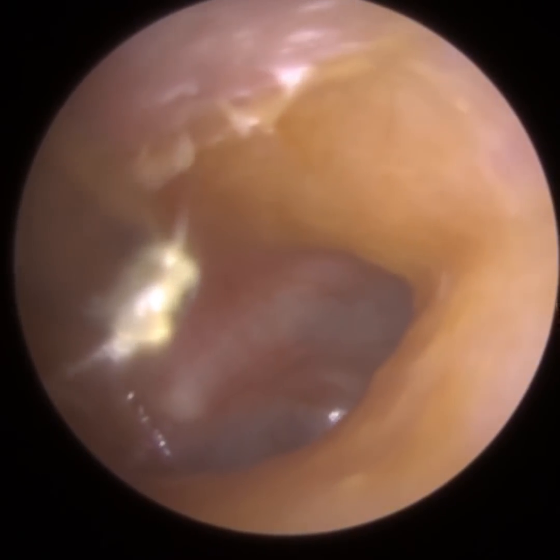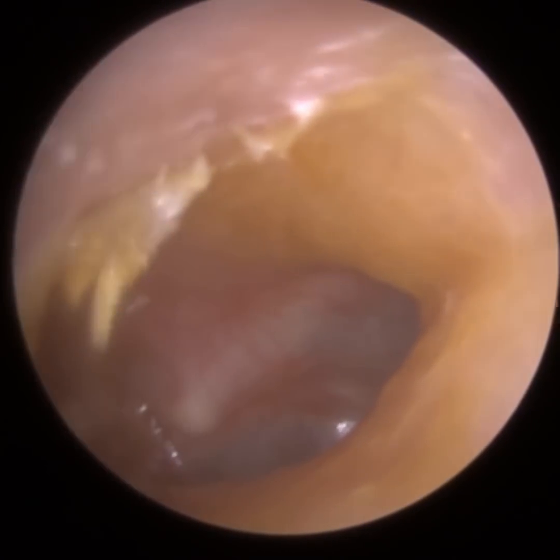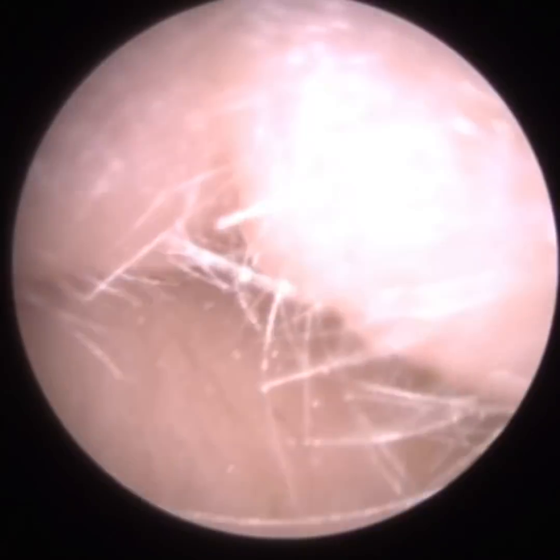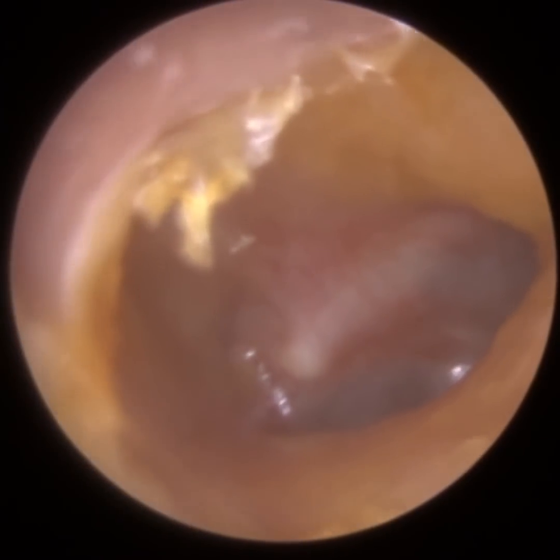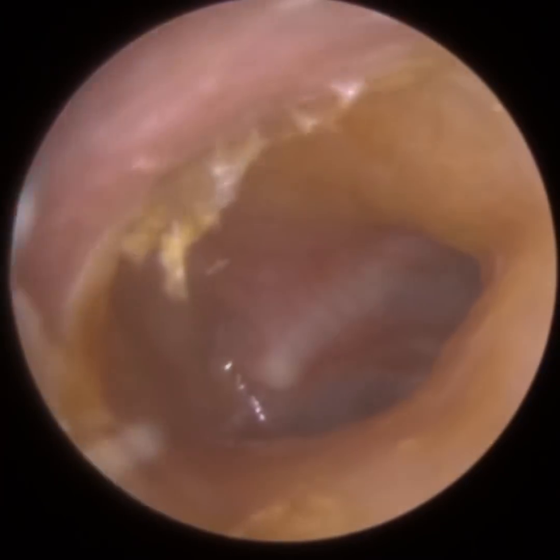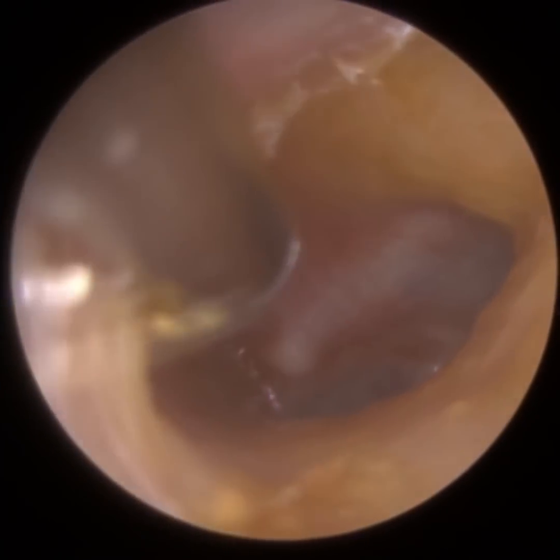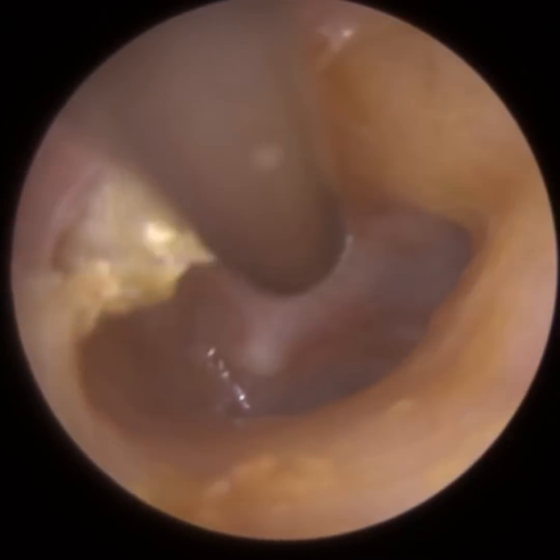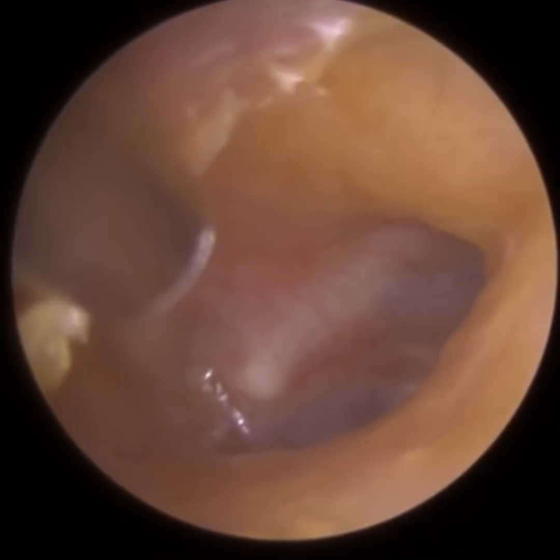When you suction, it reduces the ear temperature. Therefore, in this case at the moment, the left ear is sending reduced messages compared to the right ear. So the brain actually thinks you're moving to the right, but the patient's not. The patient's sat still, looking straight ahead, and they therefore experience what we call the caloric effect. And they experience vertigo, the room's spinning around, the eyes rotate, and it settles within a minute or so.